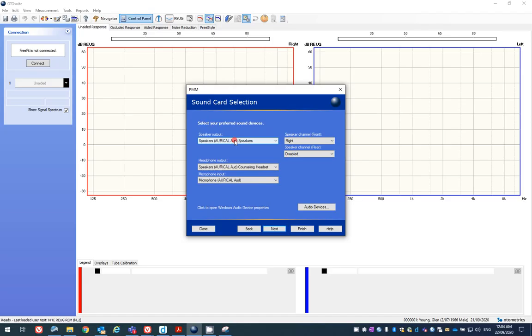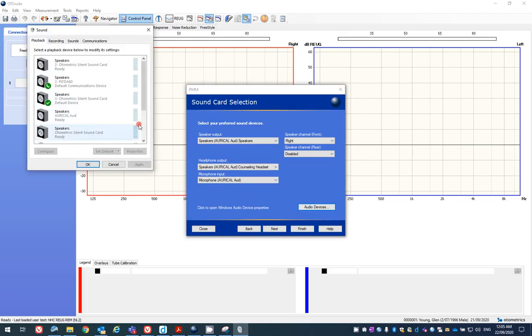While we're looking at these settings, we look at the speaker output. We've got speakers, Aurical Aud speakers selected. Headphone output needs to be set to speakers, Aurical Aud counseling headset. The microphone input needs to be microphone, Aurical Aud. If we look at our audio devices, it's important to check in here as well.